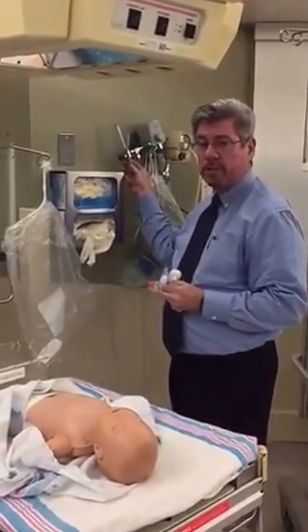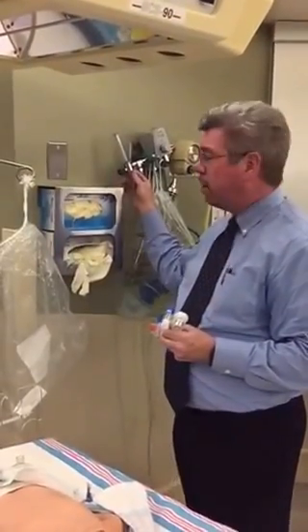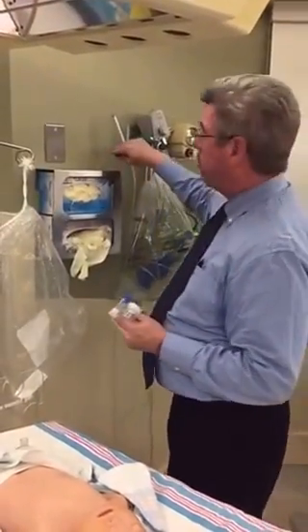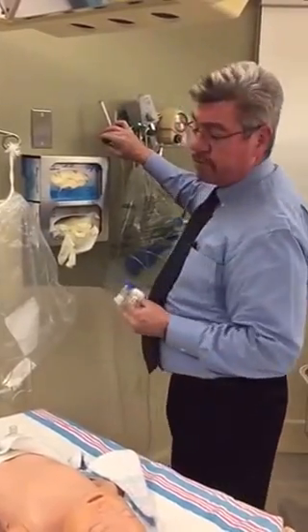It can be gas, it can be oxygen, whatever kind of flow we desire — we can use it on a blender as well. What we do now is set the flow meter up to 10 liters of flow. The reason I do 10 liters of flow is because it allows me greater versatility as far as the PEEP settings that I can set.